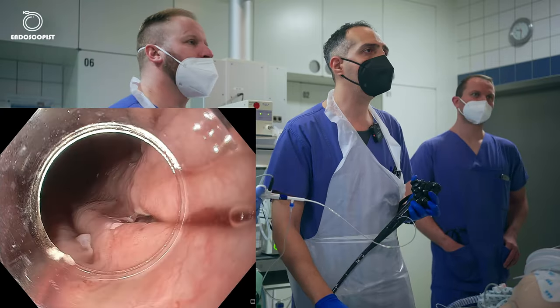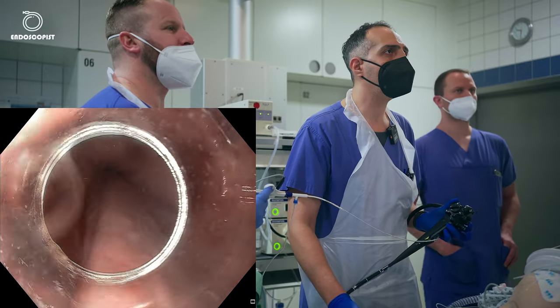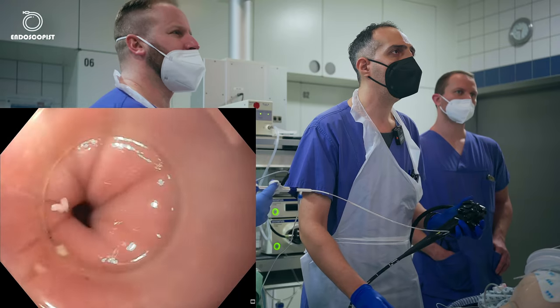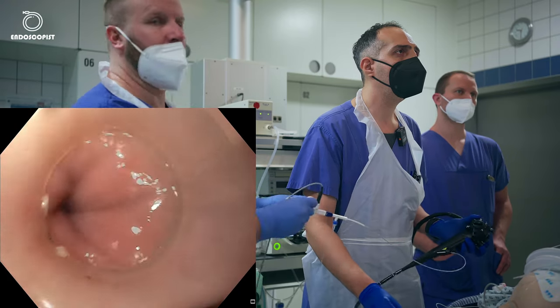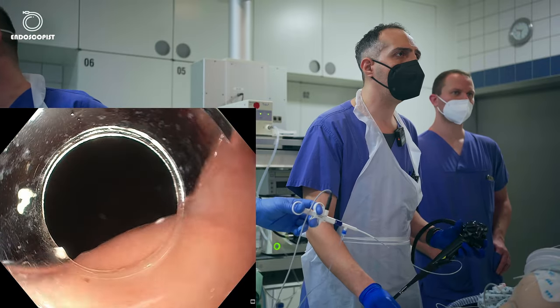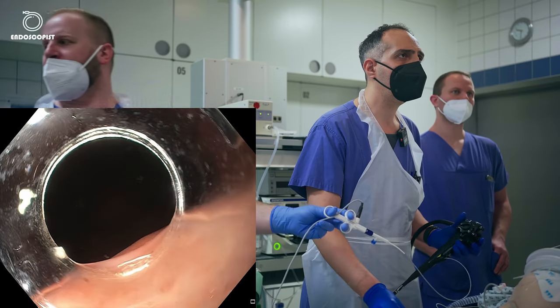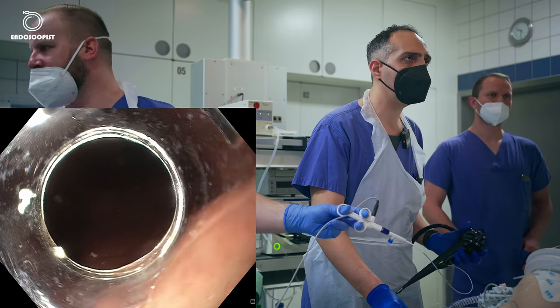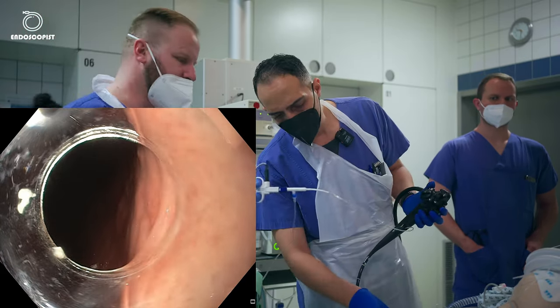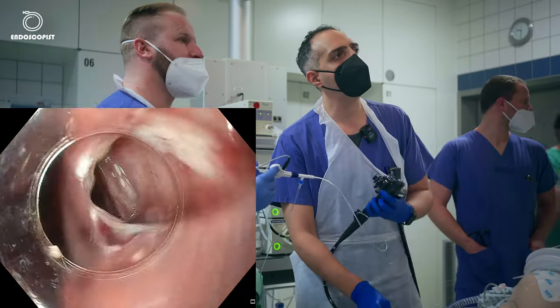Here the incision of the mucosa. As you can see here, we have our tunnel. You can see the elevation of the submucosa reaching up to the cardia. And here's the bulge. And it goes something like here. And by 5 o'clock, it will go to the stomach, till the subcardia, till here, I would say. And this for me here, by 43 centimeters, I will go again in the tunnel and I will correlate this.